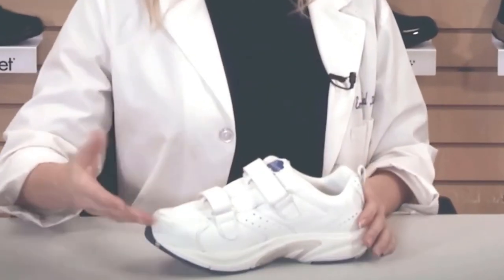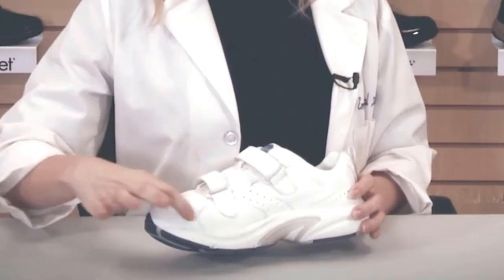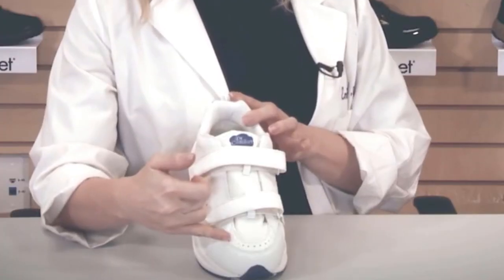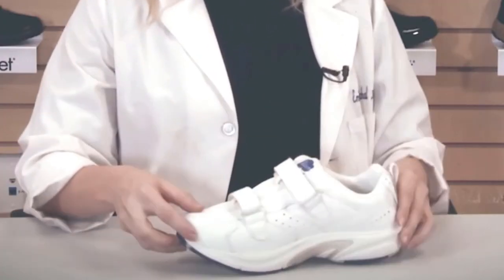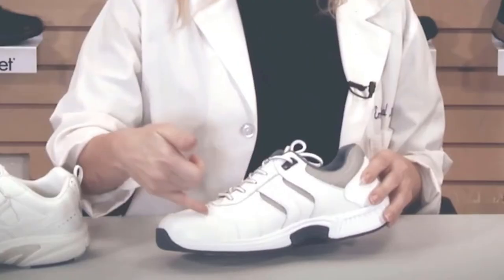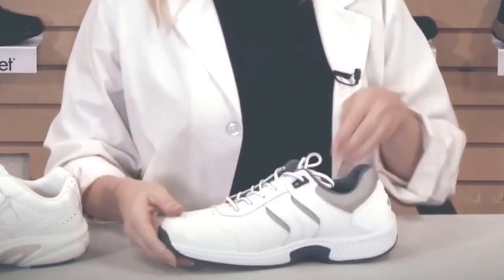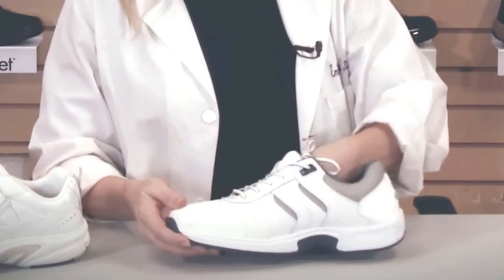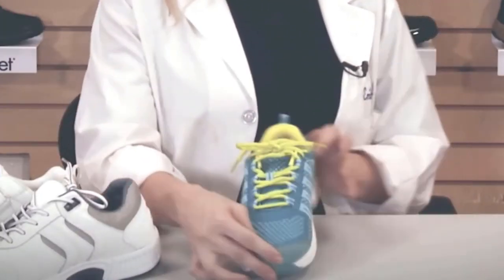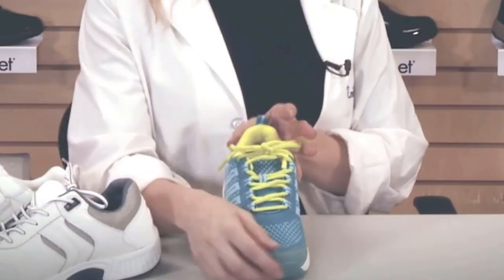Another feature of all OrthoFeet shoes is that they're designed with a non-binding upper. This is particularly important for those who have sensitive feet and may have bunions and hammer toes. A common shoe is designed with uppers that are binding and create areas of sewing and stitching, which can be irritating to the front of the foot, the toes where there might be hammer toes, or the area of the bunion. All OrthoFeet shoes have a soft top layer, with the stitching being just for design — it's not on the inside of the shoe to avoid areas of irritation. This is included on the top as well to accommodate for any hammer toes, bunions, or if you have diabetic neuropathy and sensitive feet.